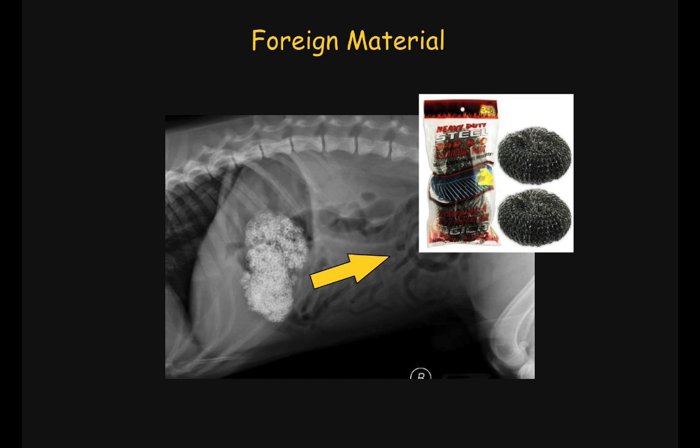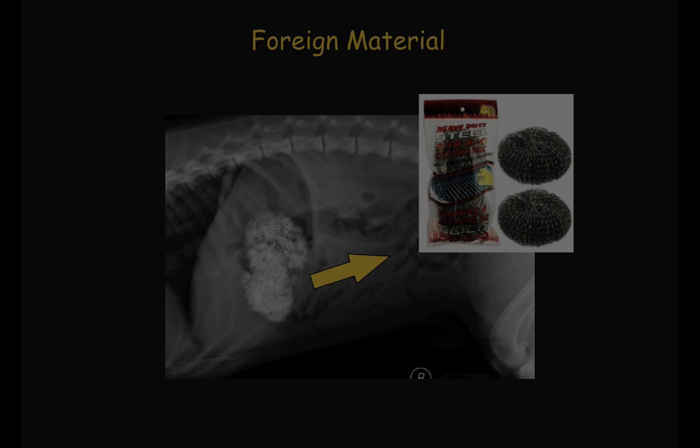However, in many instances, the foreign material cannot be detected on radiographs, and intestinal dilation may not be obvious. In experienced hands, ultrasonography is useful in diagnosing mechanical obstruction and in detecting foreign bodies. Let's review the main features encountered with them.